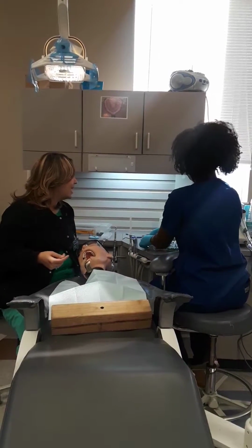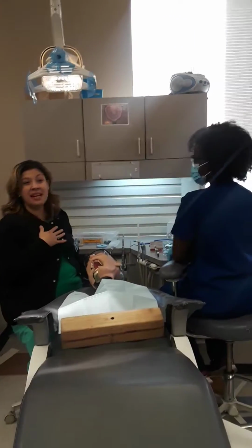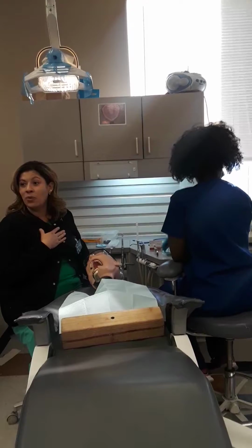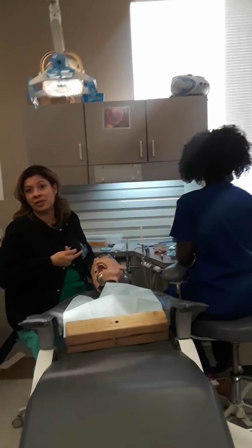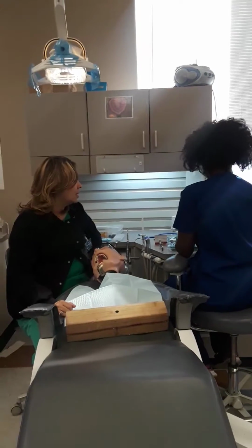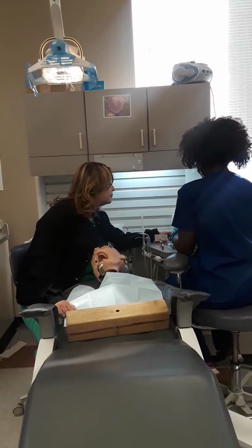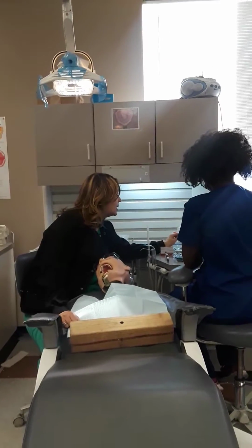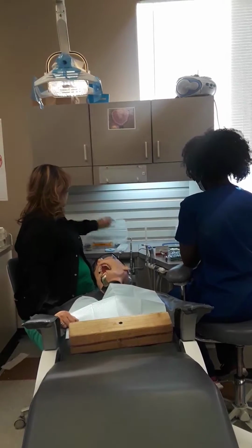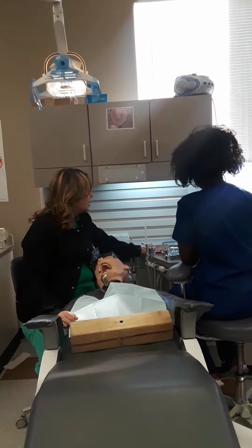Rubber dam. In 14 years, if you want to make a side note, I have never done a composite with a rubber dam. So for this checkoff, we're going to skip all those steps. Spoon. Okay. Refining instrument. Yep. Edge. Yep. Bonding brush. Bonding holder. Yep. We need, not a problem. It's there. Bonding liquid. Uh-huh.